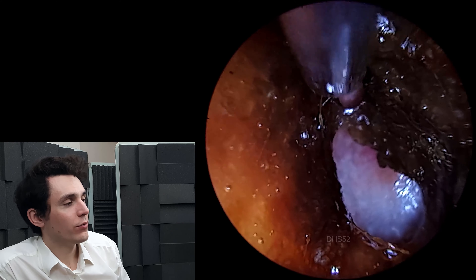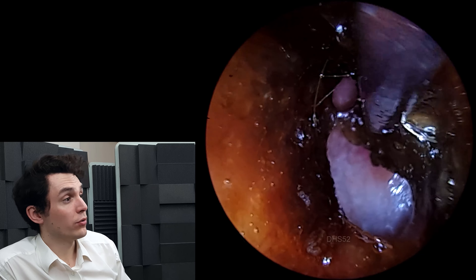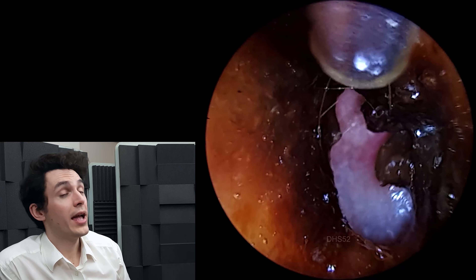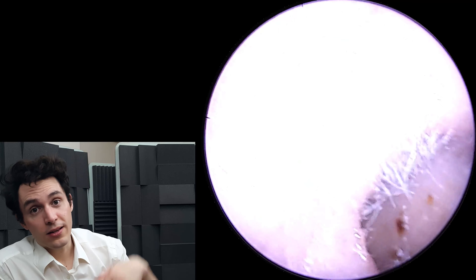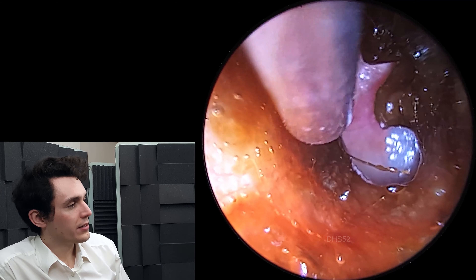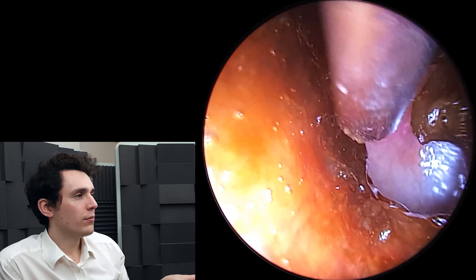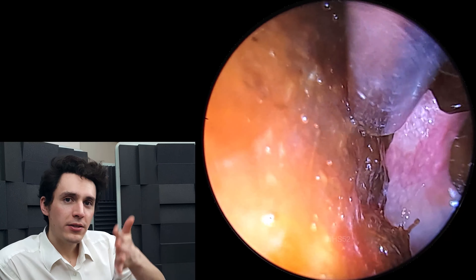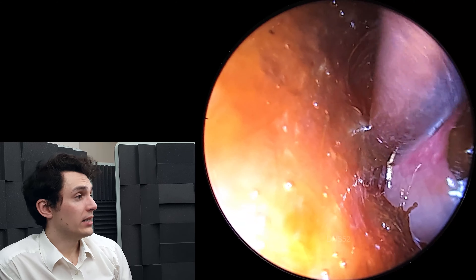So what we're doing now is cleaning up as much of this residual wax as possible, to make sure it doesn't fall back against the eardrum when they go for a shower. The last thing we want is for them to tilt their head in the shower and have all that wax just travel back down and slime up against the eardrum. So this is more of a cleanup job, a preventative measure at this point. We're not going to be able to get all of this residual wax, but we want to get as much of it as possible.